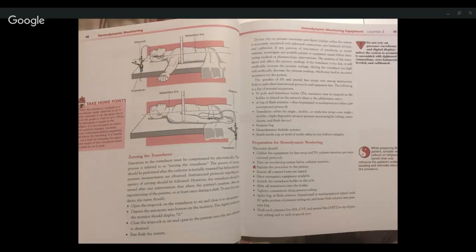Preparation for hemodynamic monitoring. You should gather the equipment for line setup and PA catheter insertion per institutional protocols. Turn on the monitoring system before catheter insertion. Explain the procedure to the patient. Ensure all consent forms are signed. Have emergency equipment available.